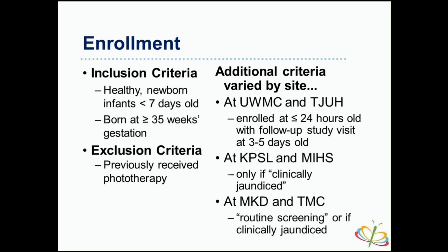Something that was interesting about the study is that they did have additional criteria, but that seemed to vary by site. Certain individuals enrolled at 2 institutions were enrolled at less than 24 hours of age, and then BiliCam images as well as serum bilirubin were collected when they were 3 to 5 days old at a follow-up visit.